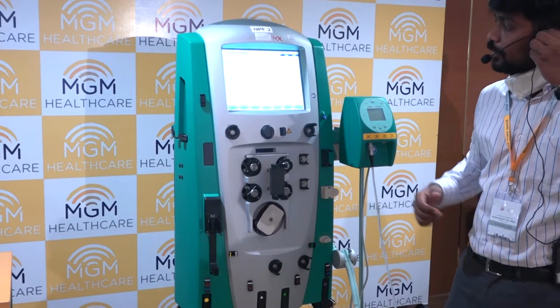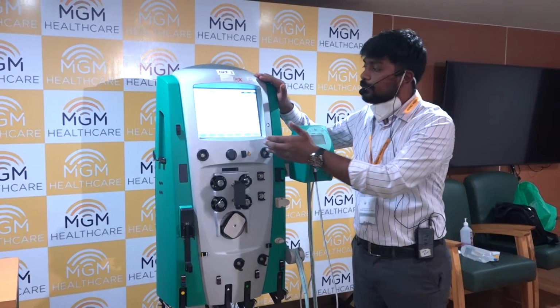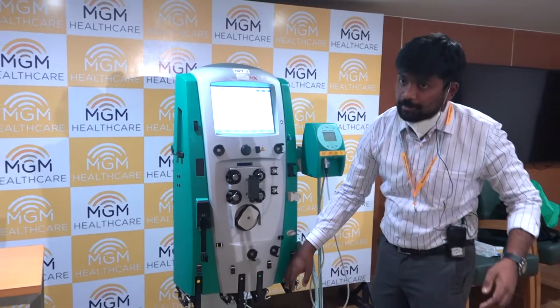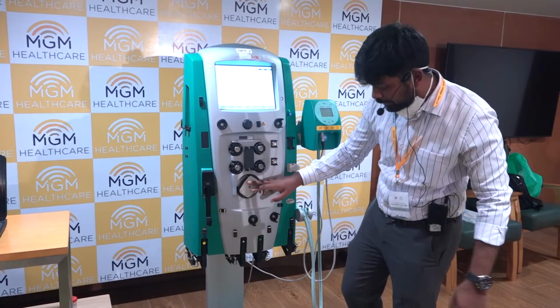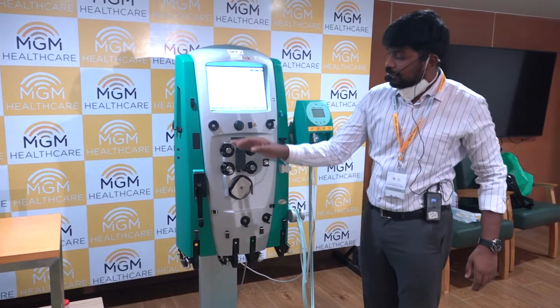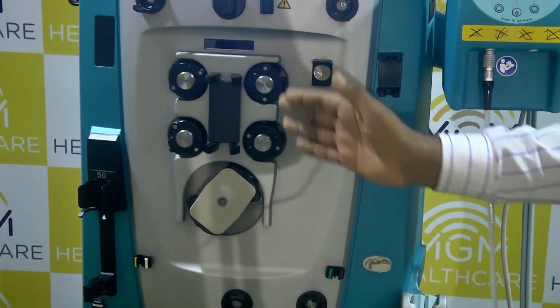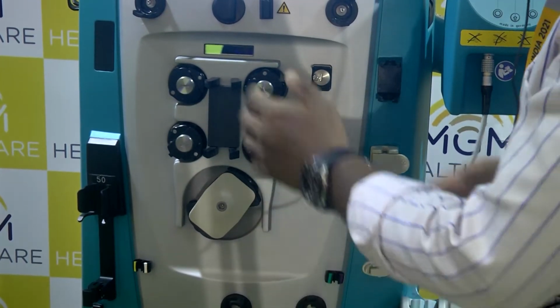What I was telling is the first part is the monitor where you get the information and give the commands to it. Then the second part is the pumps and sensors. And the last we have scales. So we have a total of five pumps. The bigger pump is the blood pump, and we have the effluent pump, pre-blood pump, dialysate pump, and replacement pump. I'll quickly tell you how to insert the kit in this.